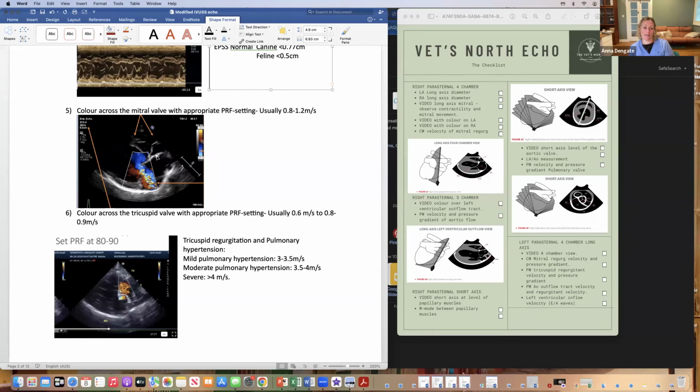But yes, particularly important for pulmonic and aortic, where we see subvalvular disease, both regurgitation and increased velocity. So we see diastolic disease as well as systolic disease in those valves quite commonly. So very important to have your window covering both pre and post valvular areas.